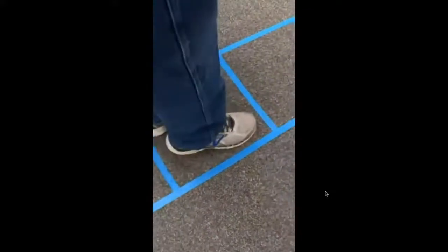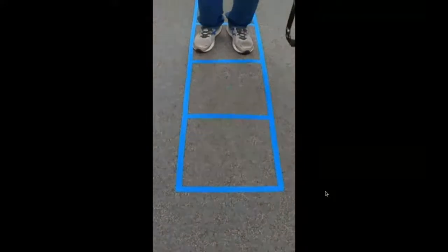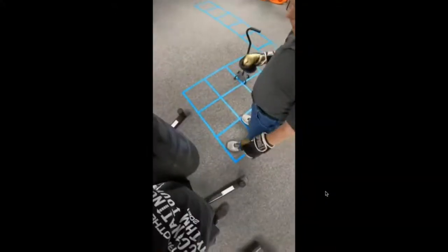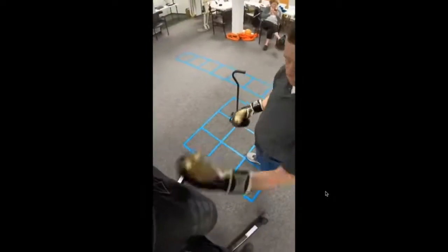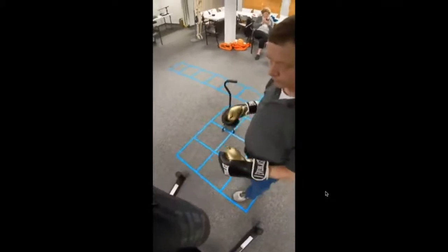Their freezing became less, so he's working on jumping drills and movement here, putting the laser where he wants to go as a motivational tool, so an external focus of attention rather than an internal focus. Hey, don't just move your feet, but go step on the laser, right? Get over there and use that external focus of attention. And they're seeing some nice things out of this clinic.